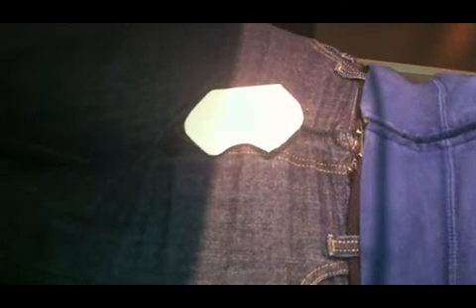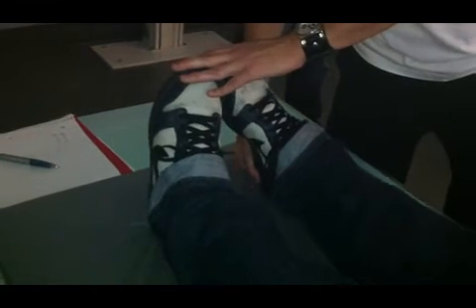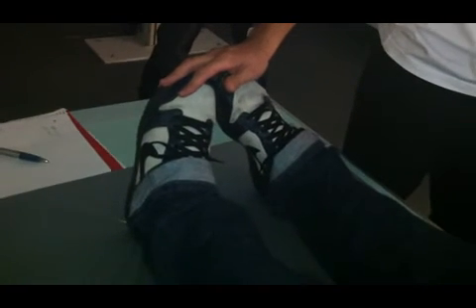The only thing we have to do from here now is bring our feet apart, toes in together. Abduct it about, I think it's 15 to 20 degrees, is what I said on there. These have to be turned in. If these aren't turned in, it's a repeat, because the lesser trochanters aren't going to hide behind there.